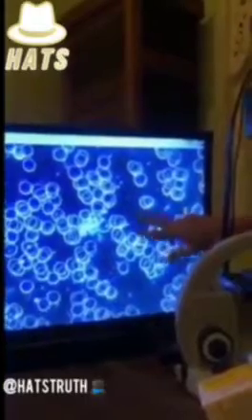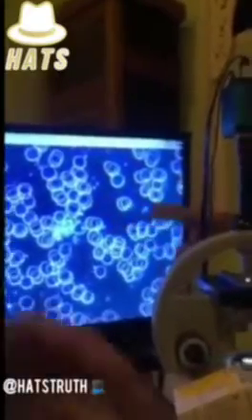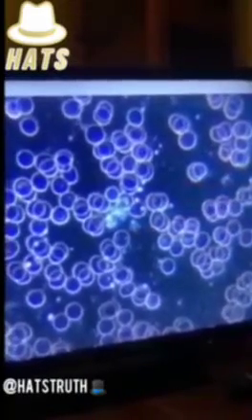Yeah, this is a dark field microscope, so we can actually do live blood analysis with this microscope. We can take the blood and look right away under the microscope, and you can still see these things are still alive. They are microorganisms, they're moving around, so this is all healthy microbes. They're very important to have in the blood. These are our red blood cells, and we're aiming here that they're really round and separated, so one by one. These are the white blood cells, the leukocytes, and you can also see there is movement in the cell, which is really important, that they're active. Yeah, so this is important to see.